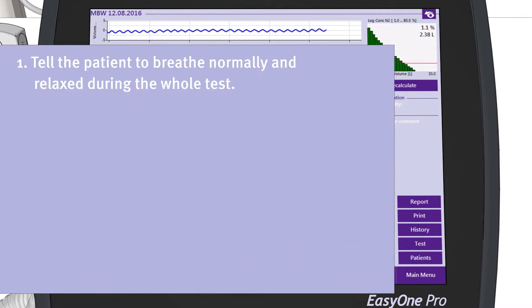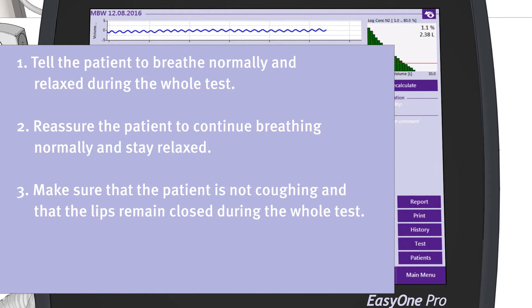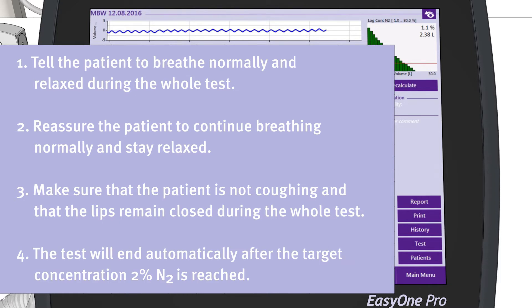To summarize: please tell the patient to breathe normally and relaxed during the whole test. Reassure the patient to continue breathing normally and stay relaxed. Make sure that the patient is not coughing and that the lips remain closed during the whole test. The test will end automatically after the target concentration of 2% N2 is reached.